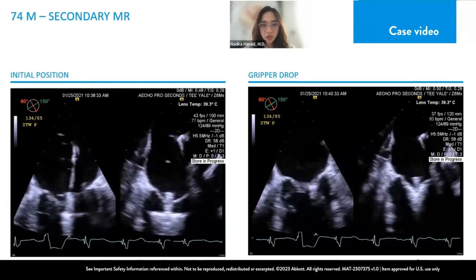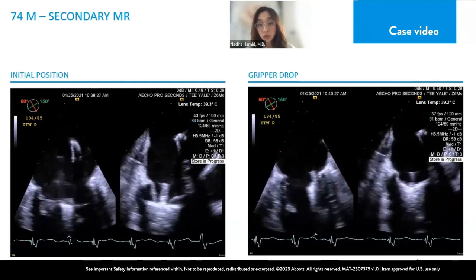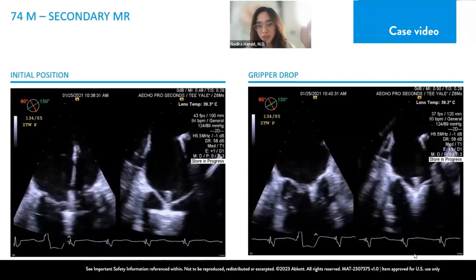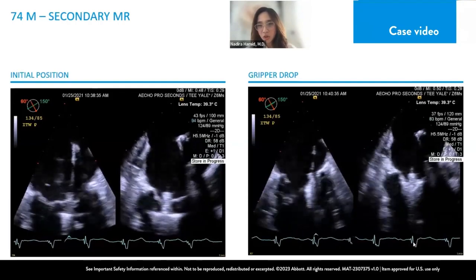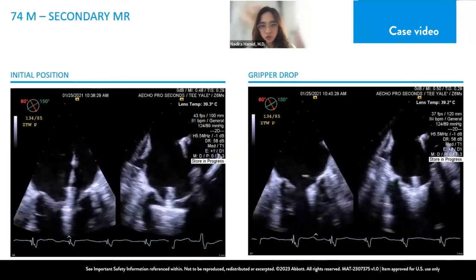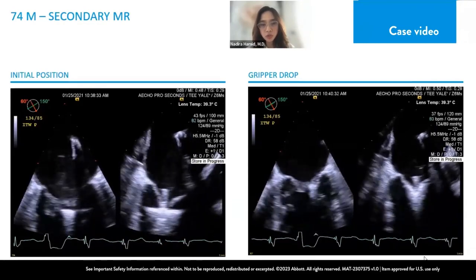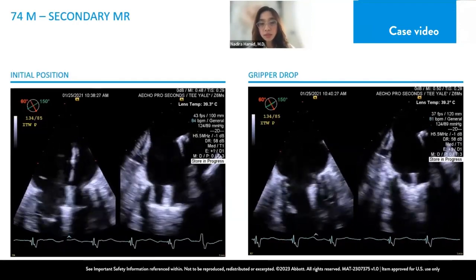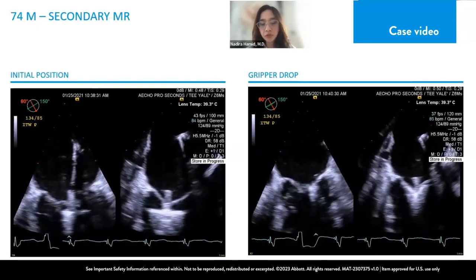Absolutely. Change the angle or position of your TEE. What you could do, I'll ask Ryan, step on the fluoro, see where your TEE probe is, and try to move right and left away from it, and then adjust the image accordingly. Use your small wheel and see if you can actually, like you say, show the shaft, or from this image, what you could do is actually use the 3D MPR as well, and see whether you can align it and see the shaft, the whole perpendicularity and trajectory of it as well.